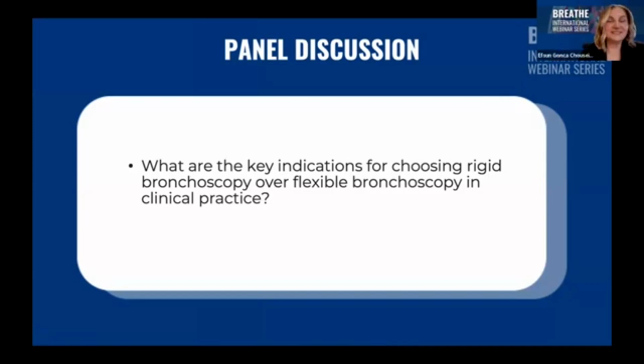Thanks, Samer, for your kind invitation, and thanks to Dr. Viswesvaran for his excellent presentation, which is full of very nice videos. I'm very excited, honored and pleased to be with my colleagues today and chat on that relevant topic. Let me categorize the key clinical indications of our daily clinical practice where rigid bronchoscopy is superior to flexible bronchoscopy into three main groups. First, foreign body removal. Second, central airway obstructions and massive hemoptysis. Let's focus first on foreign body removal.